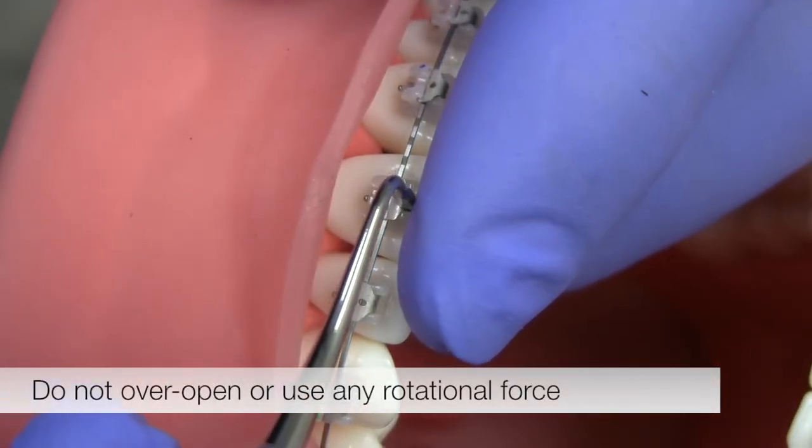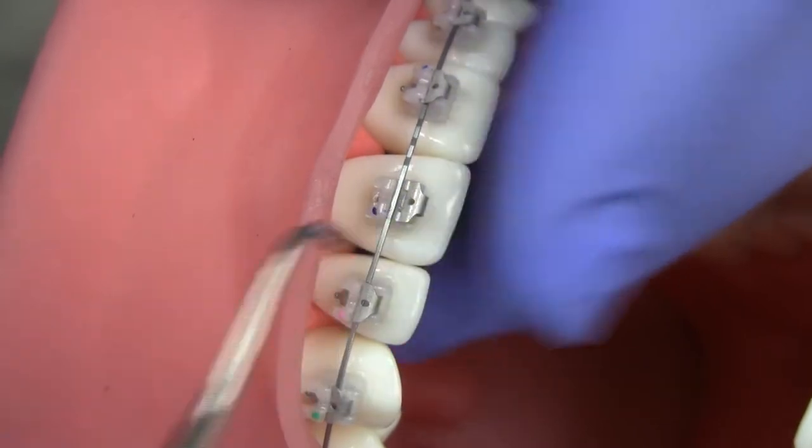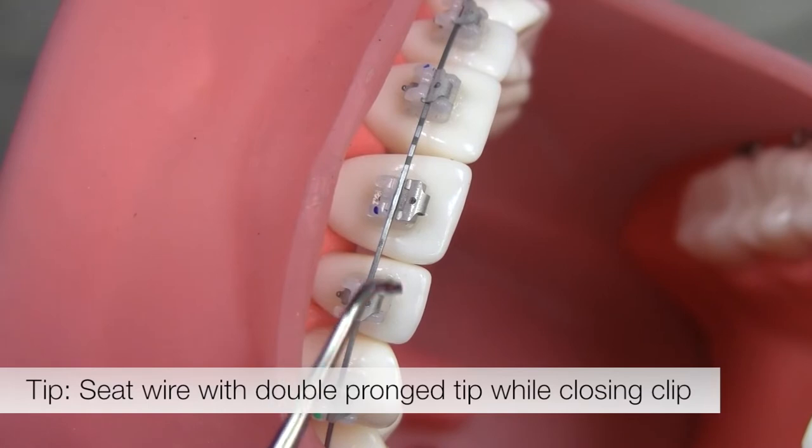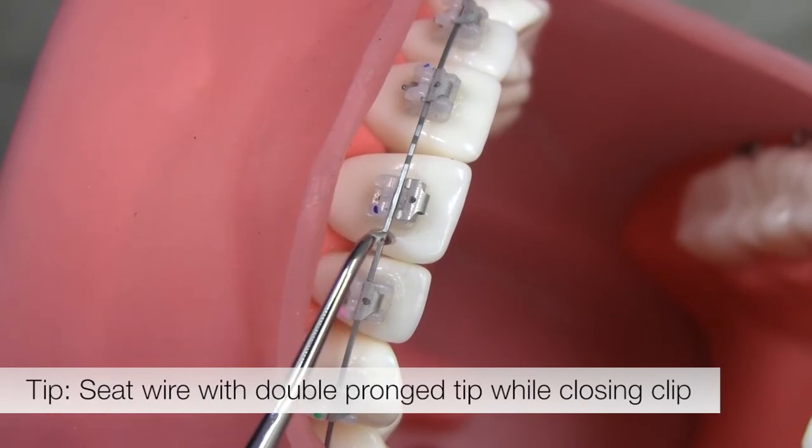Don't over-open or use any rotational force as this could distort the clip. Here's a tip: use the double prong end of the instrument to pull the arch wire into the bottom of the slot while you close the clip door.